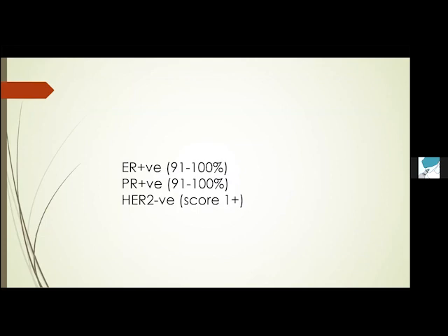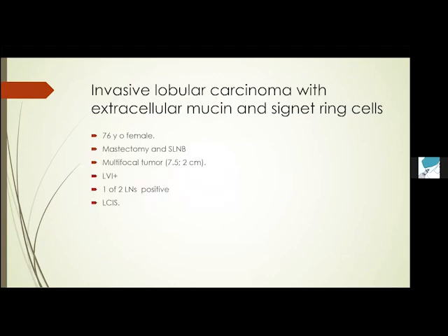mammaglobin was negative. E-cadherin was negative in all these areas as well. The tumor was positive for ER and PR and was negative for HER2 by immunohistochemistry.